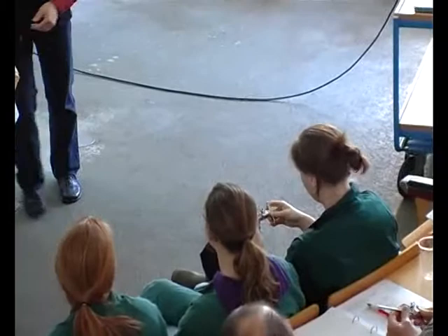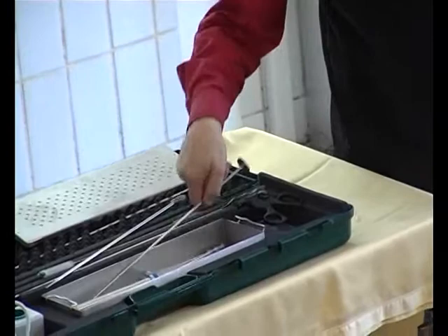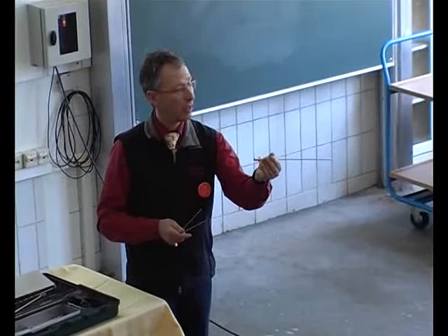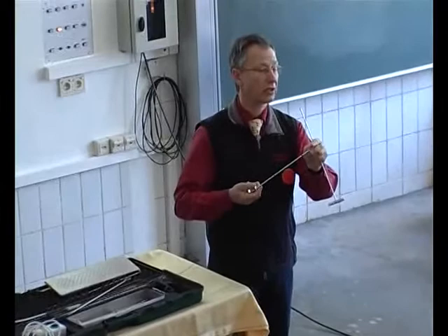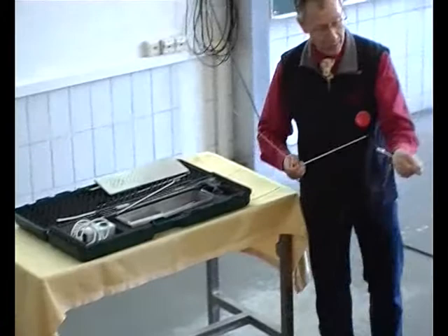The next part is the toggle placing trocar. This set consists of three parts: a sharp trocar, also with a special tip, the cannula without valve, and the suture pushing part, which is naturally just as long as the cannula, so that you are absolutely sure that this trocar or this toggle which you push through is really in the abomasum. So I also will pass this to you.